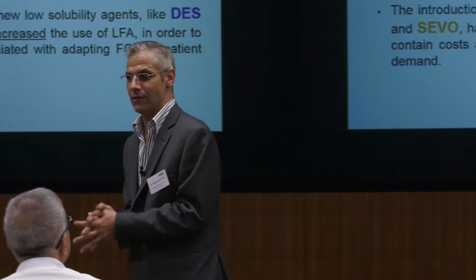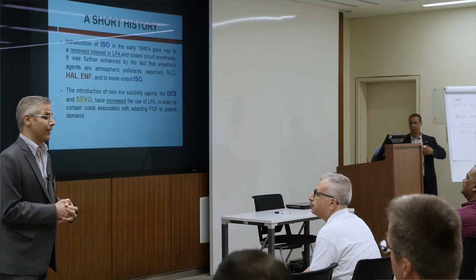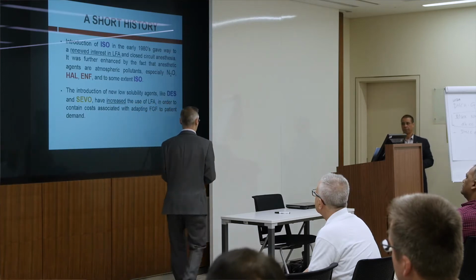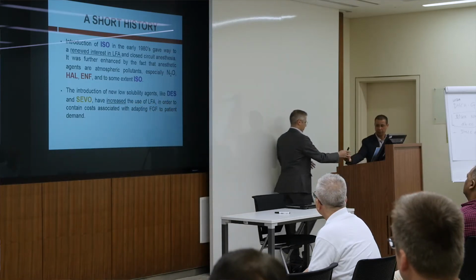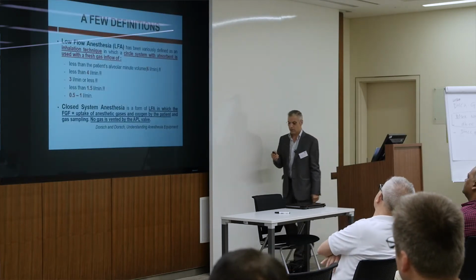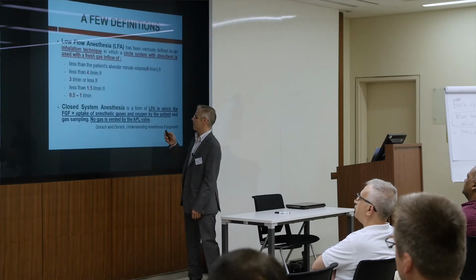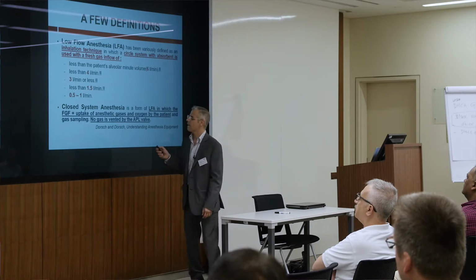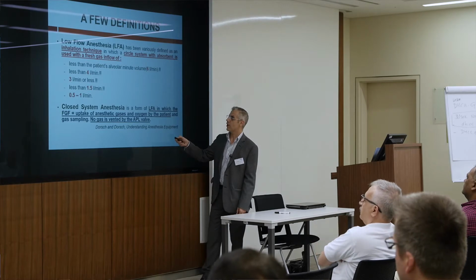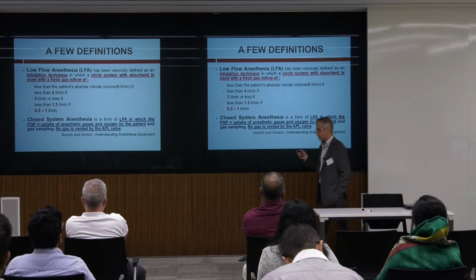So what's the right answer? After a lot of definitions, they reached the final definition of low flow anesthesia, which is less than 1.5 liter. Yeah, so this was the history of defining low flow anesthesia. And finally, they reached it, as we will discover in the next slide.